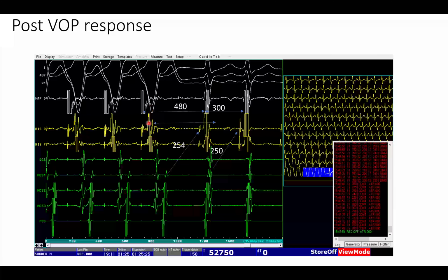So when you have a VAV tachycardia, atrial tachycardia is out, the possibility of AVNRT and AVRT is there. Although we have already discussed that when it is an A on V tachycardia, the possibility of accessory pathway mediated tachycardia is very, very far. I'll not go into complicated nodofascicular pathways and all, but extranodal pathways are out.